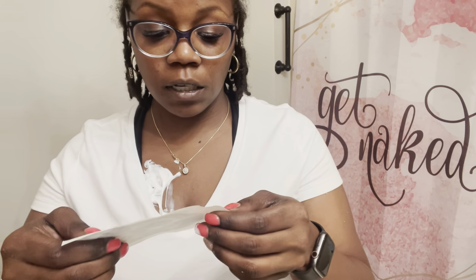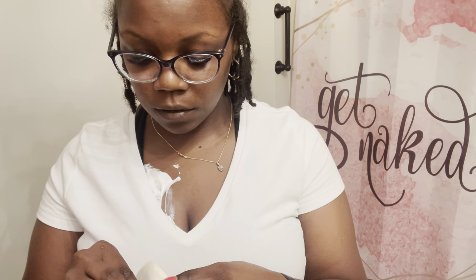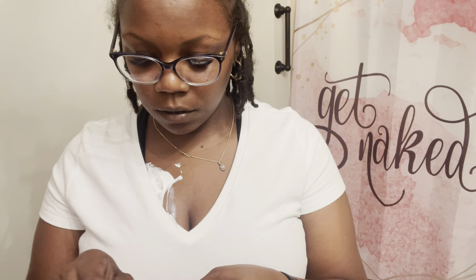Then I'll take this - which you can get from your nurse at the oncology building - open it, and take off this part.